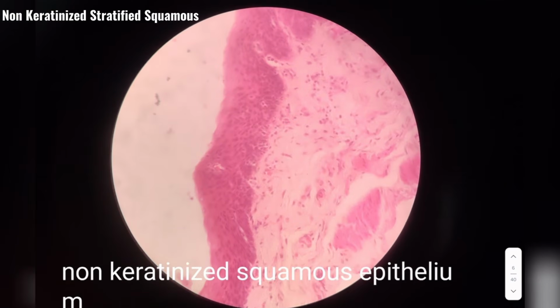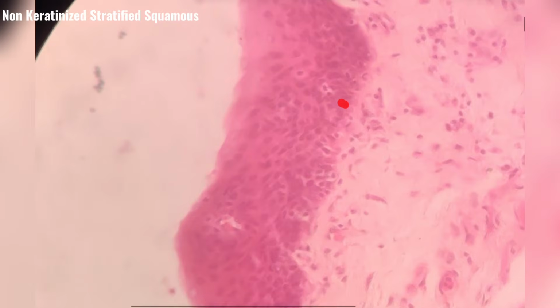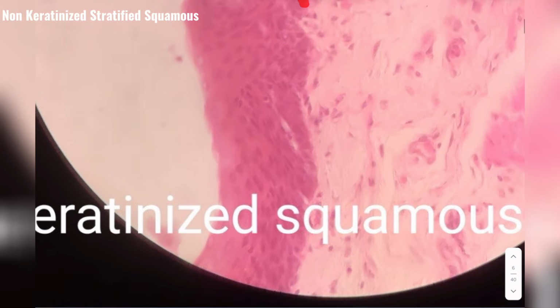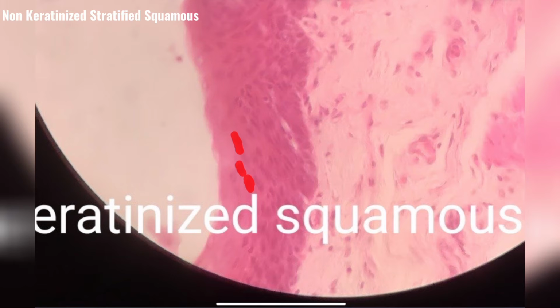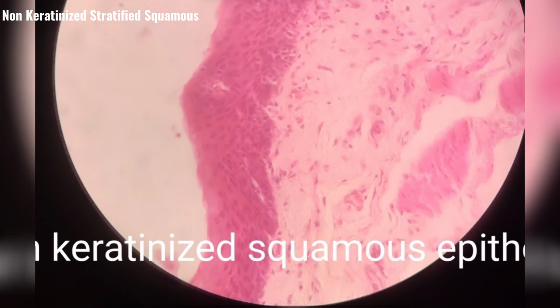Next. So we are done with simple epithelium. Now let's look at compound epithelium. What did I say? In compound epithelium, you will find nucleus present at different levels in multiple layers. So you can find lots of nucleus in one layer, nucleus in multiple layers. But then what you need to observe are the cells at the top. The cells at the top, since they contain flat nucleus, the nucleus are present in multiple layers, stratified. Since the topmost cells are flat, it is stratified squamous epithelium.